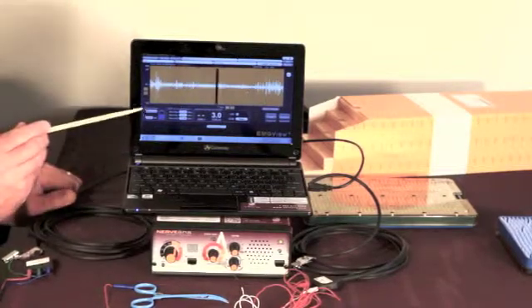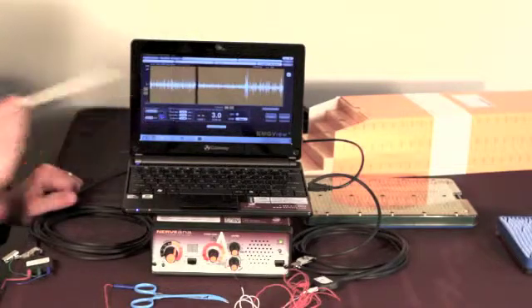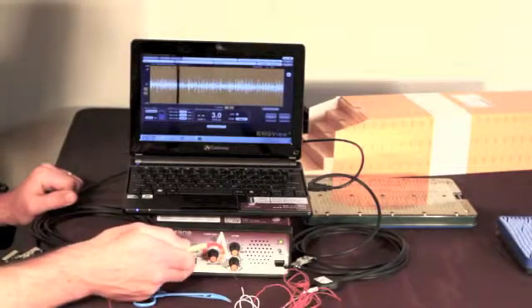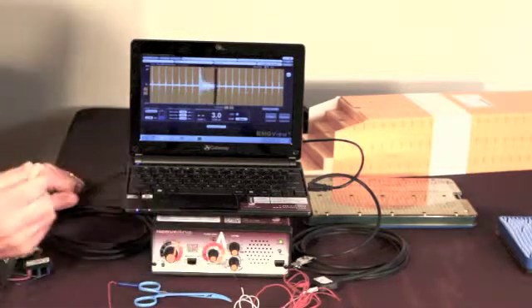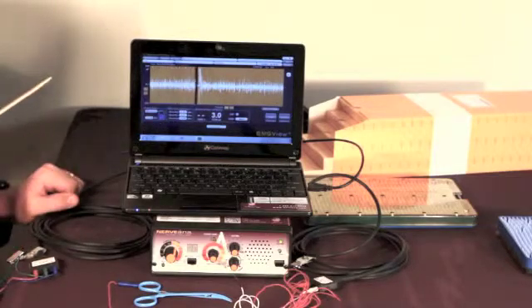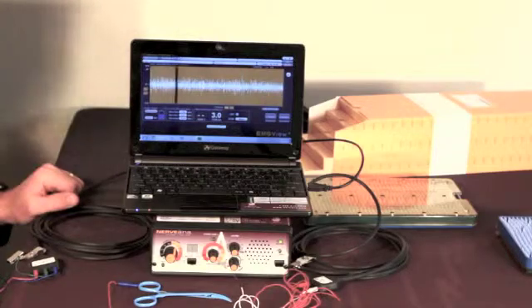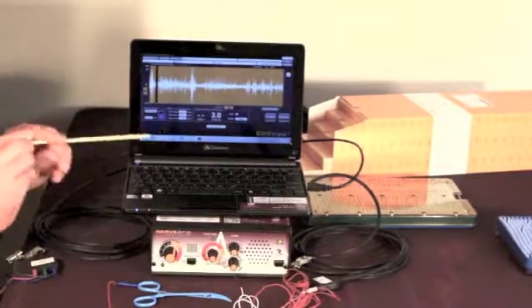And right now we have a battery discharging over here on the battery status. We have our impedance readings, which I need to do now just starting the case. So I'm going to go ahead and hold my test button. And those numbers went ahead and updated, and they stay saved on the screen. So I have 7.45, 6.01, and 11.84. Those are all good impedances for hydrogel electrodes.